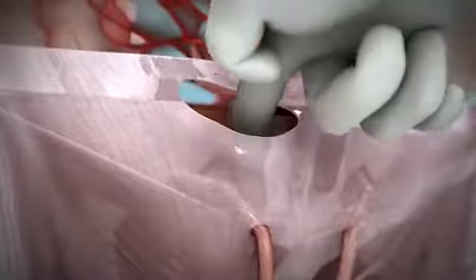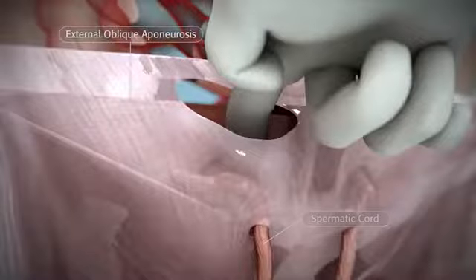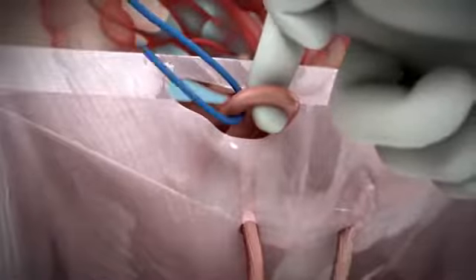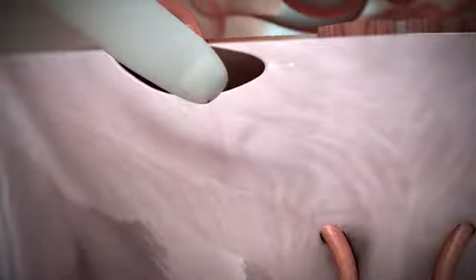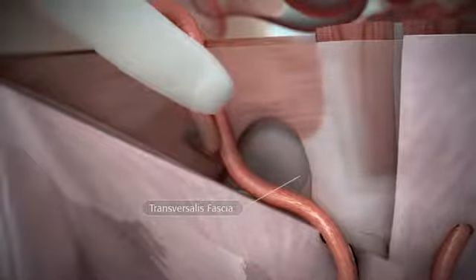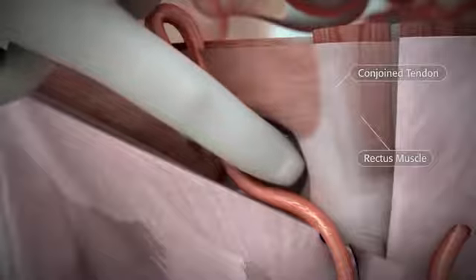Identify and mobilize the spermatic cord from the posterior wall of the external oblique aponeurosis. Elevate the cord up and out of the incision site and isolate with a surgical loop. Digitally explore the transversalis fascia down to the pubic bone and obliquely enter the space of Retzius.